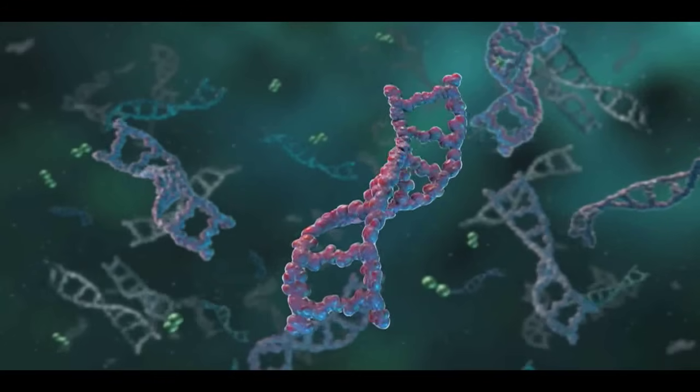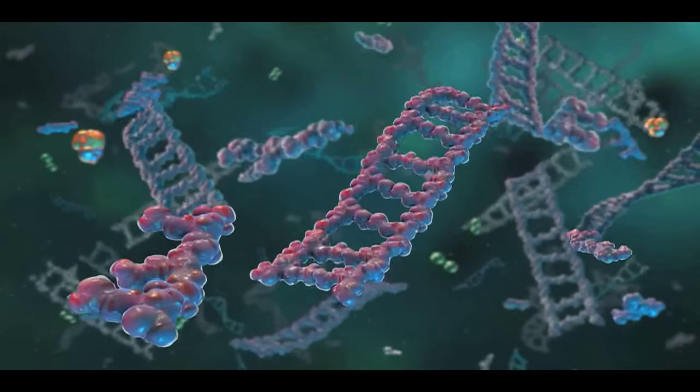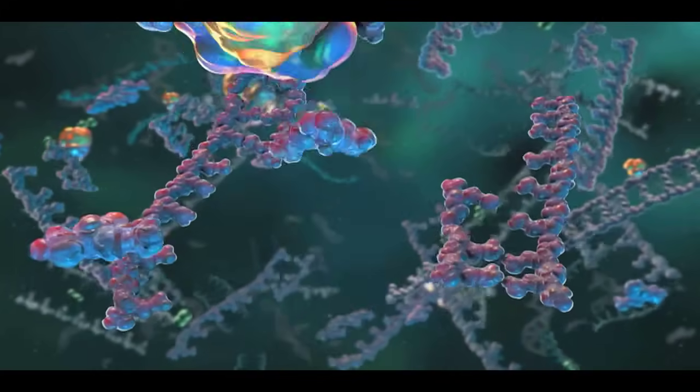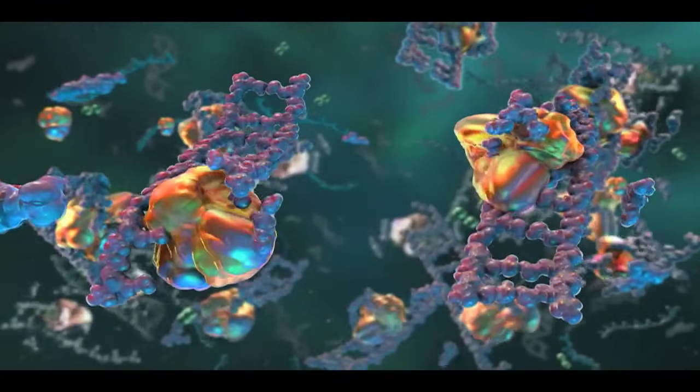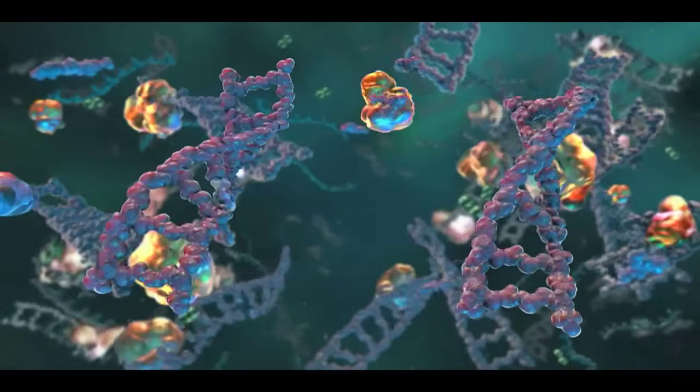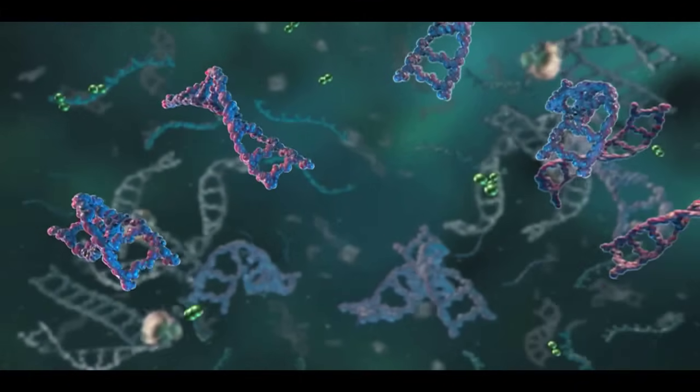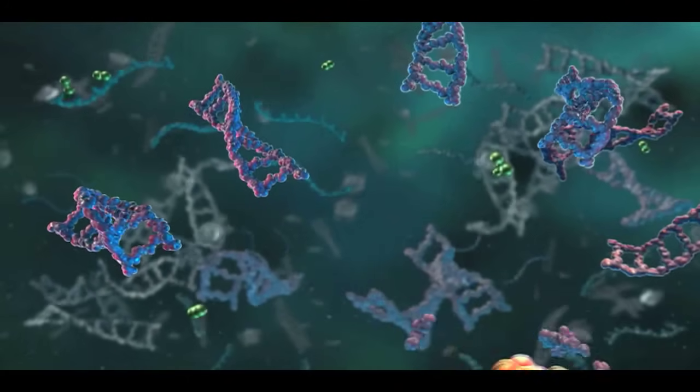Each well of this array is pre-spotted with one pair of second stage PCR primers. These second stage PCR primers are designed to amplify sequences contained within the products from the first stage PCR. This eliminates non-specific products associated with traditional multiplex PCR, because the second stage primers specifically amplify only target DNA.